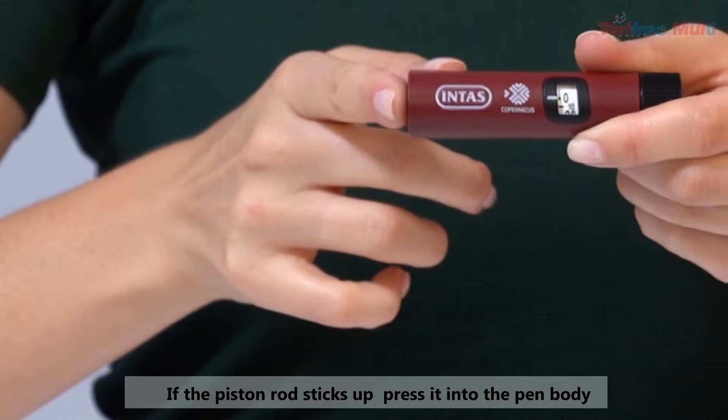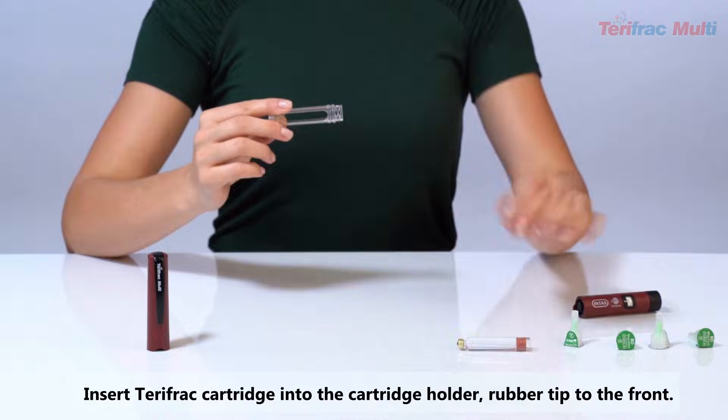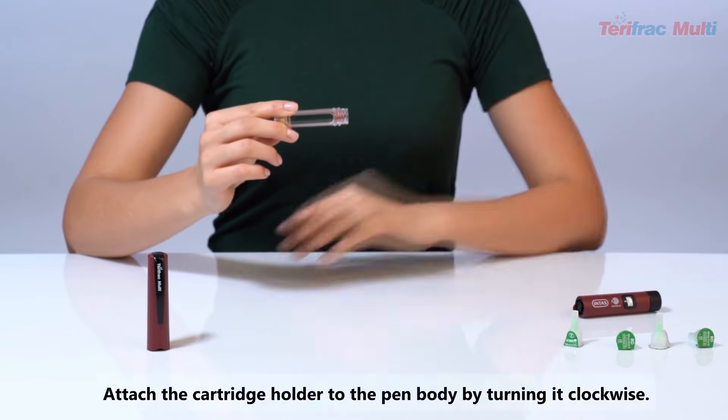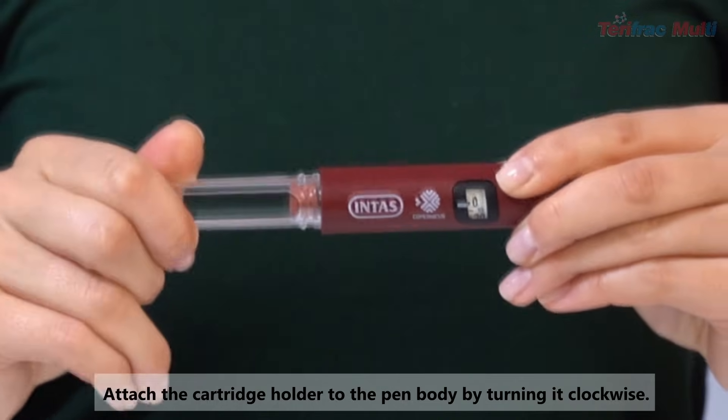If the position rod sticks up, press it into the pen body. Insert the TerriFrac cartridge into the cartridge holder with the rubber tip to the front. Attach the cartridge holder to the pen body by turning it clockwise.